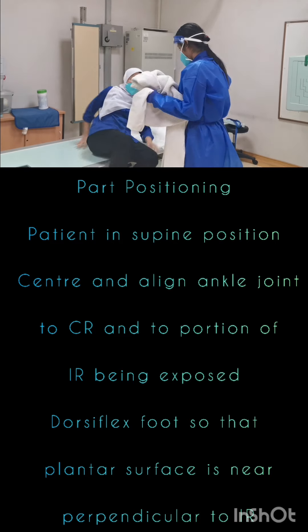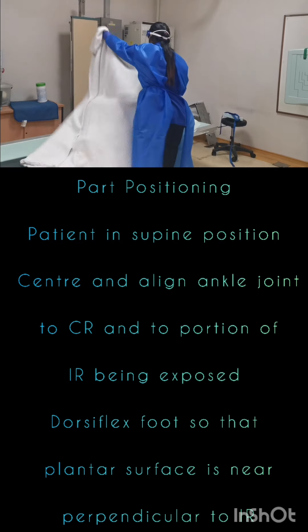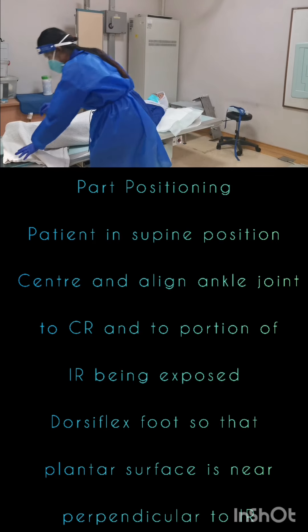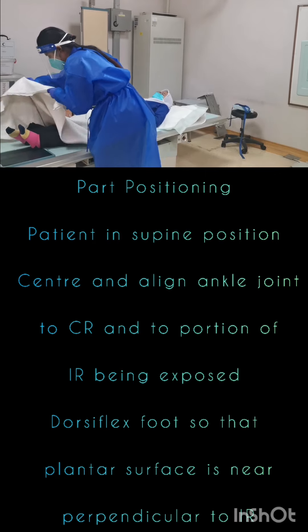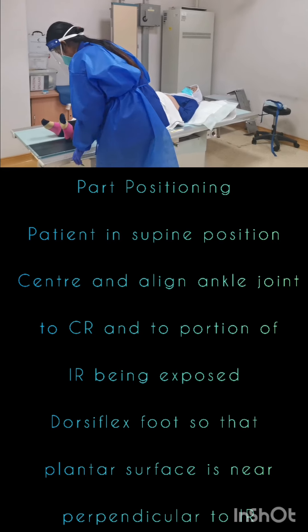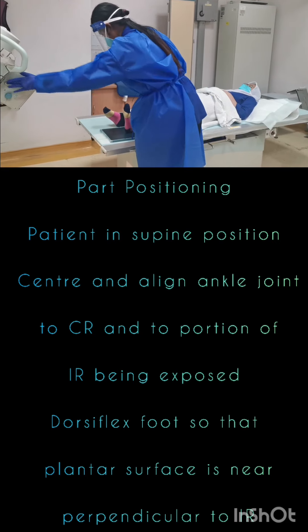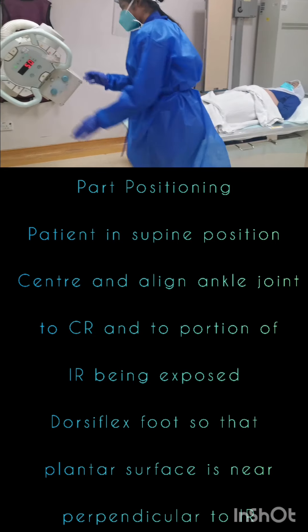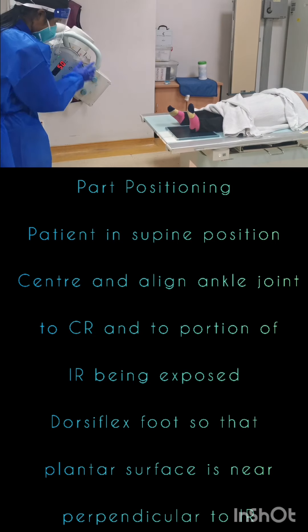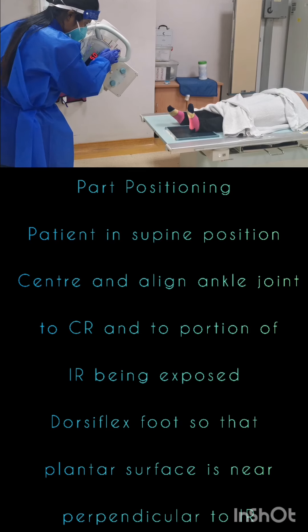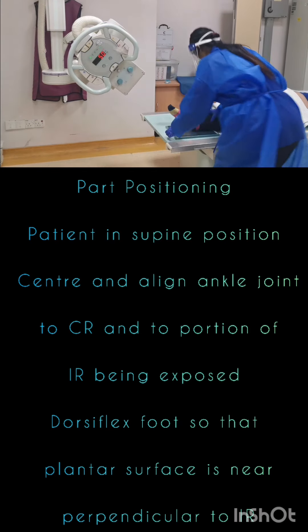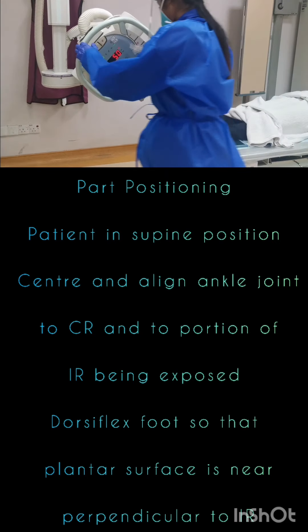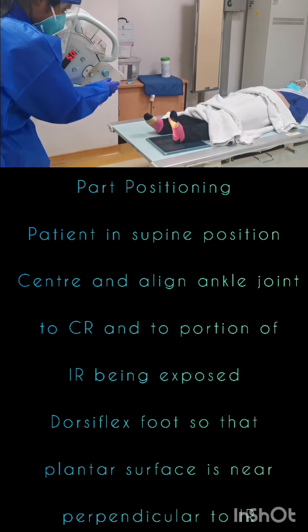After the patient is ready, I will ask the patient to lie in a supine position. I will put a blanket over her for comfort and privacy. I will then center and align the ankle joint to the CR and to the portion of the IR being exposed.